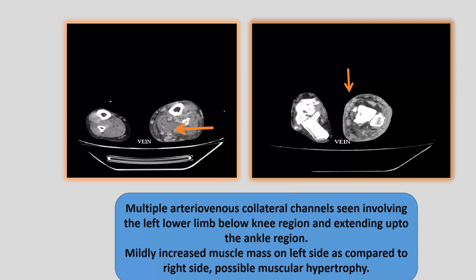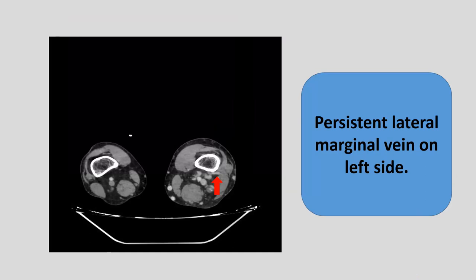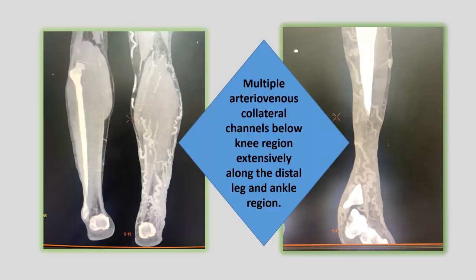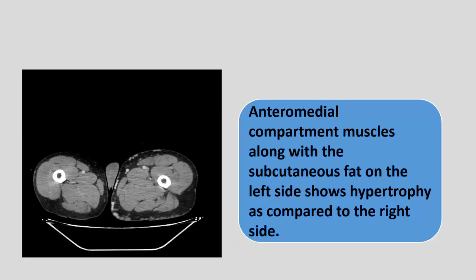There were multiple arteriovenous collateral channels seen involving the left lower limb below the knee region and extending up to the ankle region. Mildly increased muscle mass on the left side as compared to the right side — possible muscular hypertrophy. The persistent lateral marginal vein was seen on the left side. On coronal images, we can see the multiple arteriovenous collateral channels below the knee region extensively along the distal leg and ankle region. The anteromedial compartment muscles along with the subcutaneous fat on the left side show hypertrophy as compared to the right side.